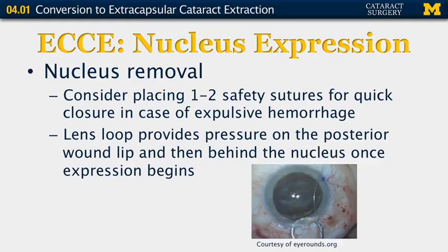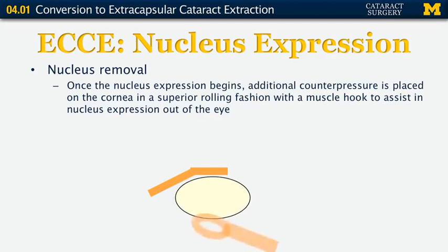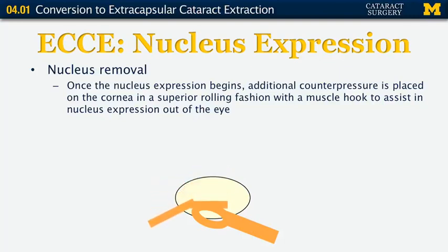In removing the nucleus, you may want to consider placing a couple of safety sutures — one on either end of the wound. These can be used for quick closure in case of the unforeseen complication of expulsive hemorrhage during nucleus expression. A lens loop is then used to provide posterior pressure on the posterior lip of the wound and then behind the nucleus once expression begins. You'll also have a muscle hook available; once nucleus expression begins, you'll use the muscle hook to add counter pressure on the surface of the cornea, rolling in a superior rolling fashion to assist in expressing the nucleus out of the eye.